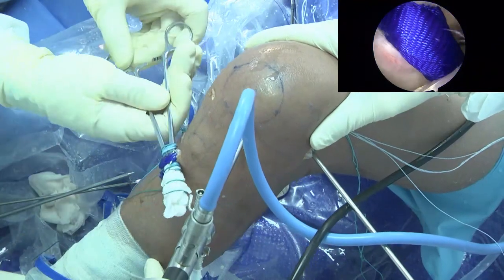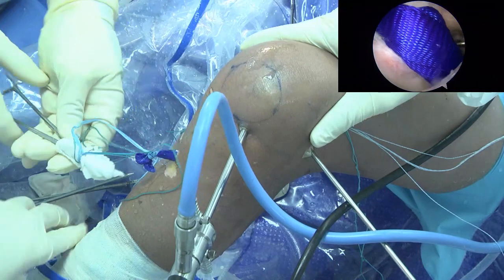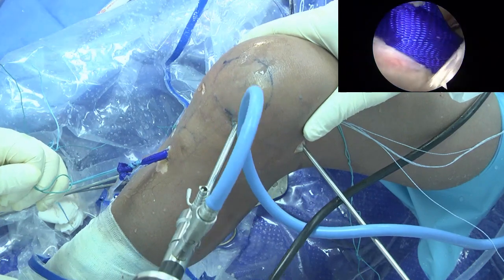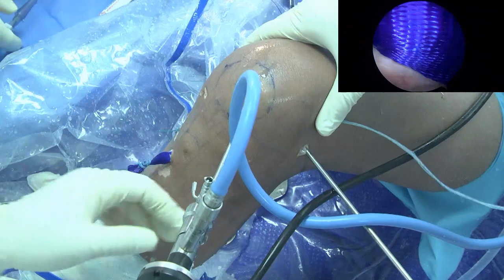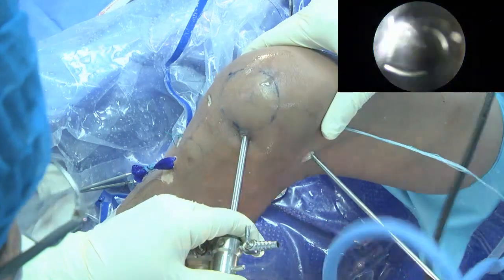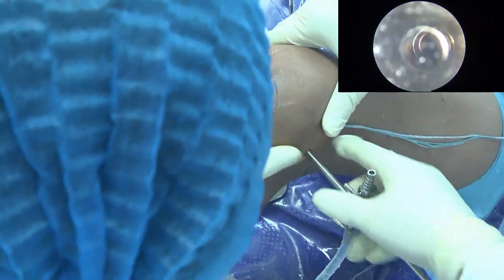Very good. Okay. So now I switch my camera. Pull a little bit. Here. So that will follow your PCL graft. You see that? Okay, the PCL graft is in place. Actually, I will put my guide pin into the tunnel before that, but I forgot to show you. Same as ACL, I will put the guide pin in first before we put the graft, because then you will not cut the graft.